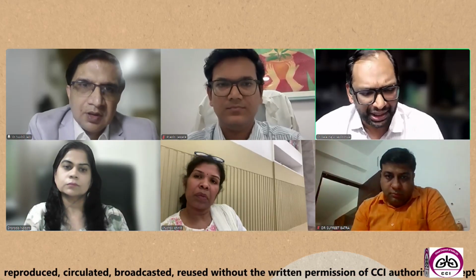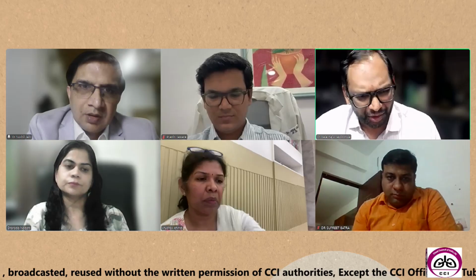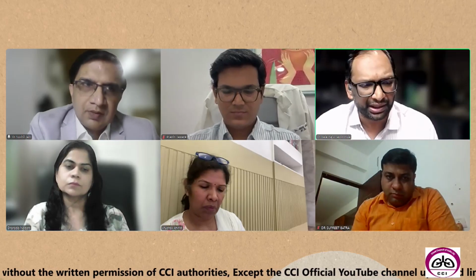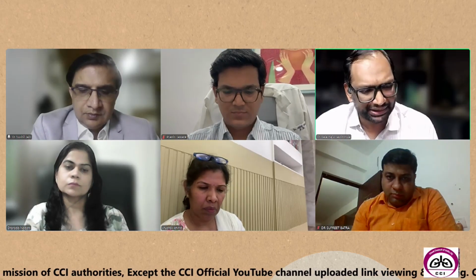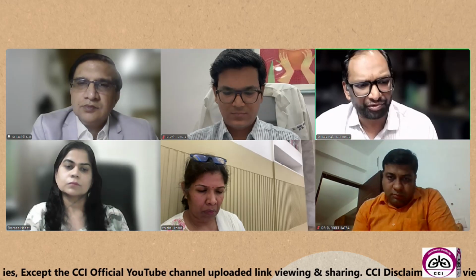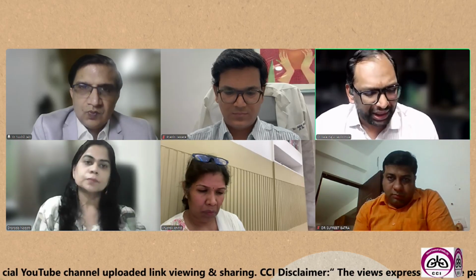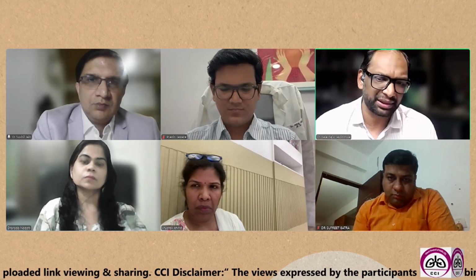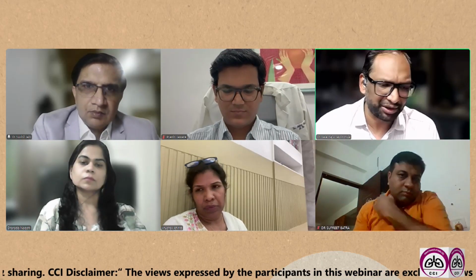I don't remember when was the last time I had to do a repeat EBUS. Usually what happens, again, Vrushali madam has already touched on it. It all depends upon your pretest probability, what you are trying to deal with upfront. Most of the times you will get at least some clue about what this node or lesion we are targeting is. I categorize into three: granuloma, lymphoma, malignancy. If your pretest probability says lymphoma, yes, you get ready upfront with intranodal cryobiopsy. Otherwise, usually I don't do intranodal cryobiopsies for all the cases.